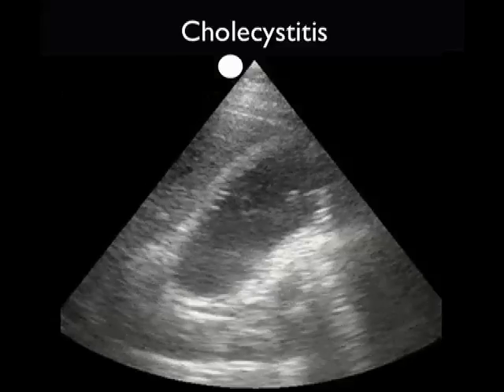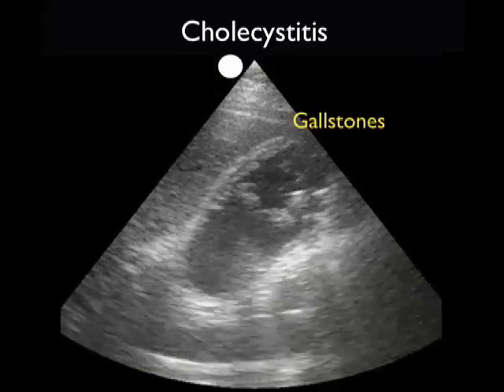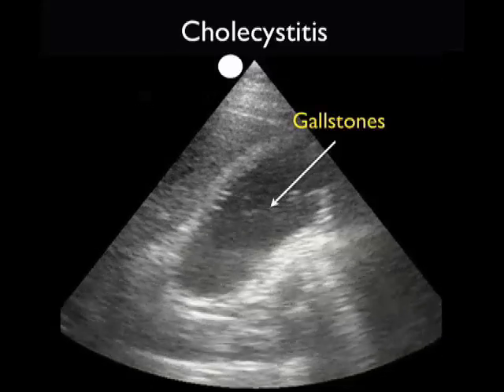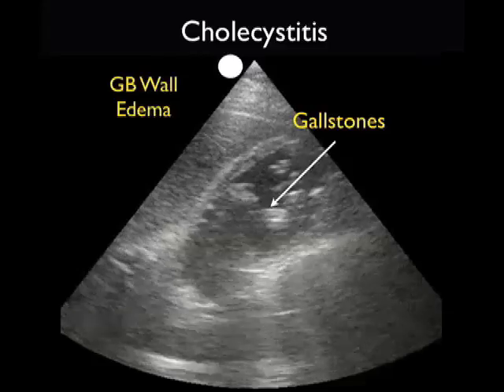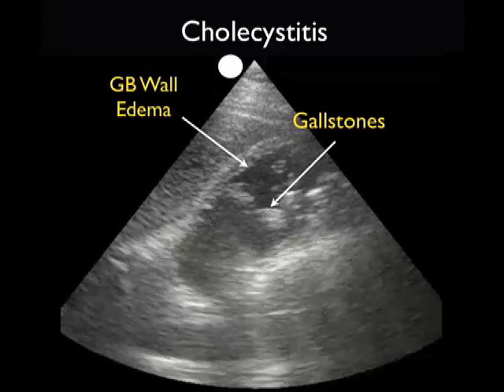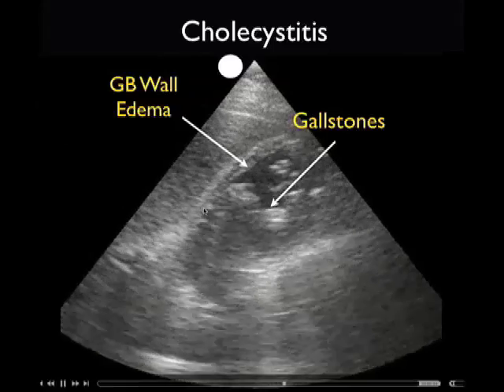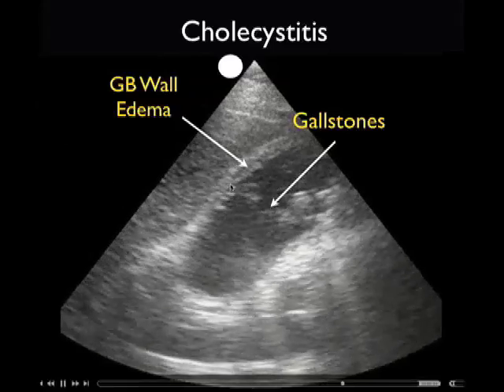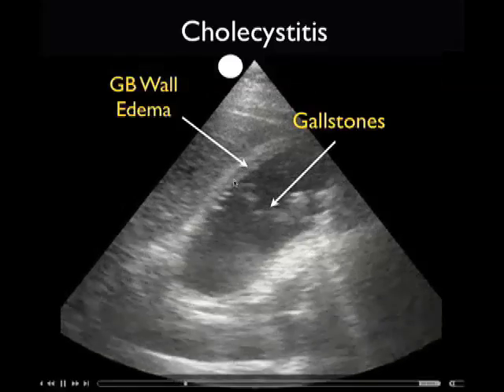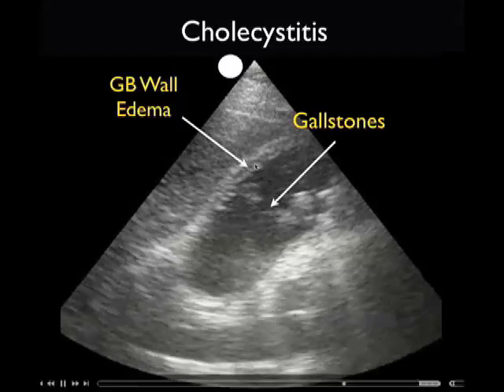This video clip shows another finding of acute cholecystitis. In addition to the multiple gallstones that we see within the gallbladder lumen, we appreciate a thickened anterior gallbladder wall. And within the wall of the gallbladder, we see a stripe of black fluid consistent with gallbladder wall edema. Here with the small indicator arrow, I'm going to trace out that area of gallbladder wall edema within that anterior wall of the gallbladder.